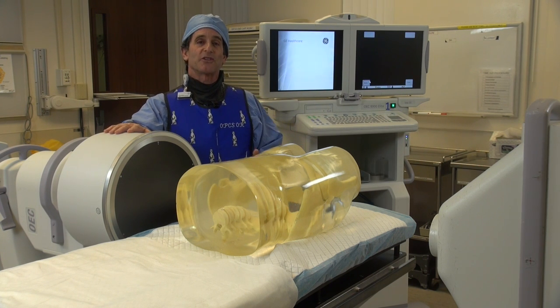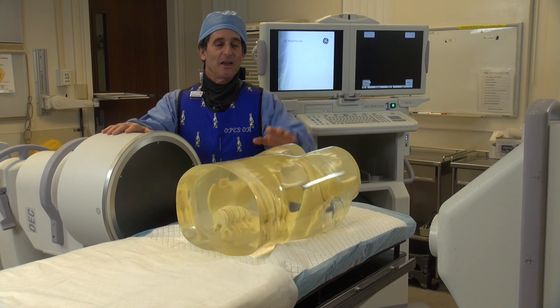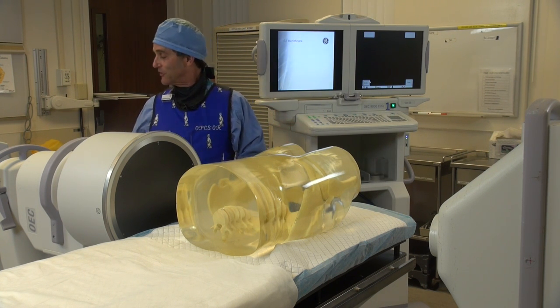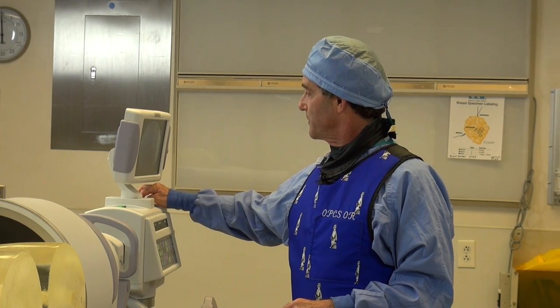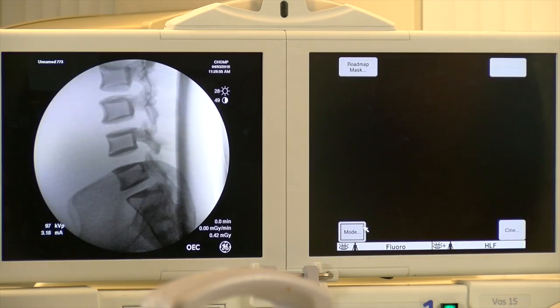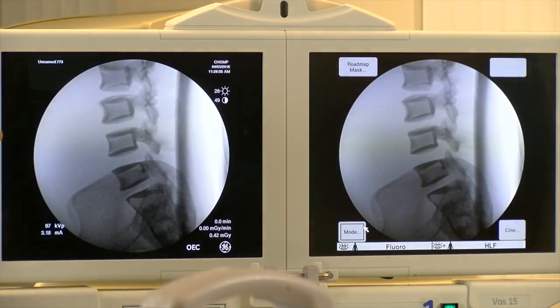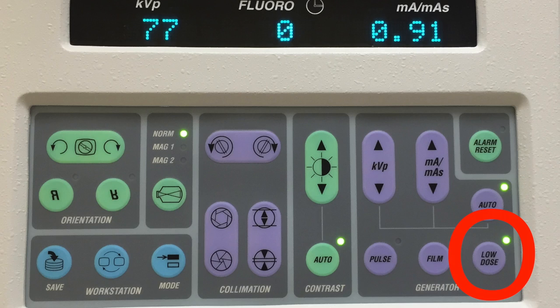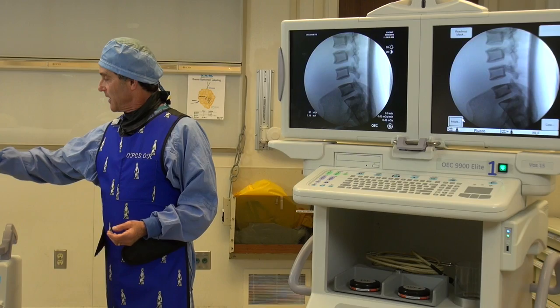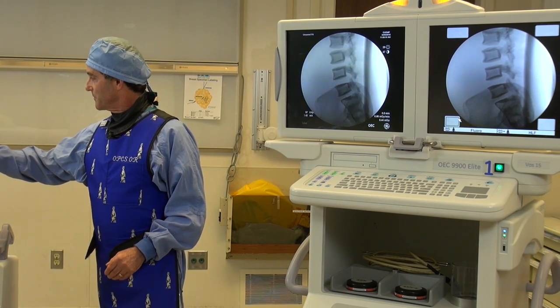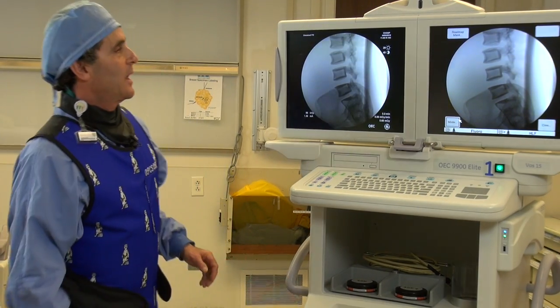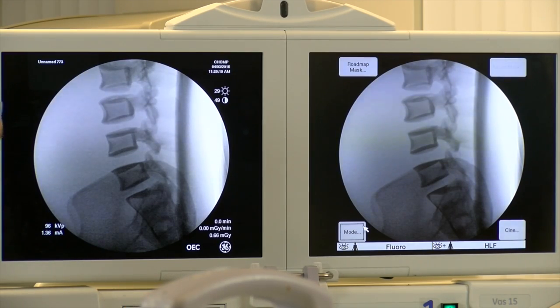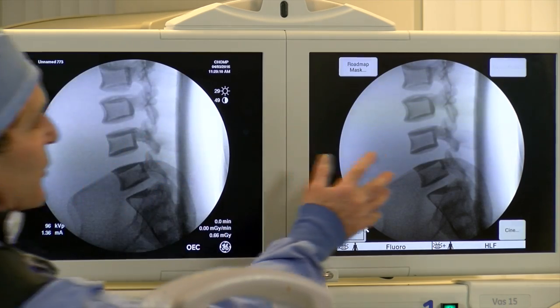So the first thing we're going to do is go ahead and X-ray our lateral lumbar, and then we'll do it on low-dose next. So we'll make the first exposure. And there we go. Now we'll go ahead and send that over to the other screen. And now I'll go ahead and make the next exposure on low-dose — I'm going to hit the low-dose button. And I can see where I'm standing that this is just a mottlier looking image.